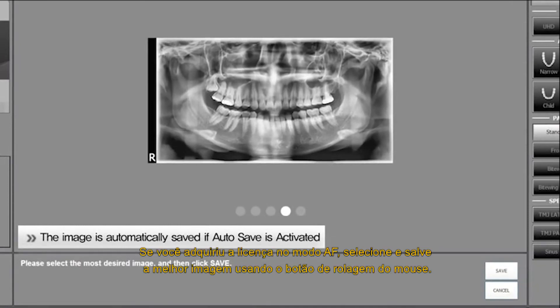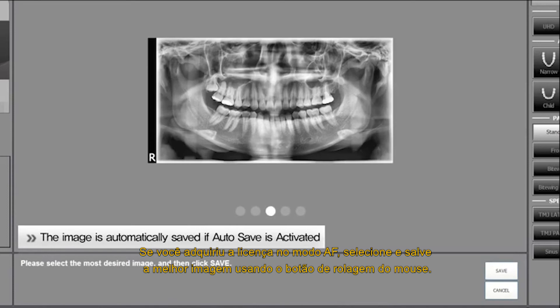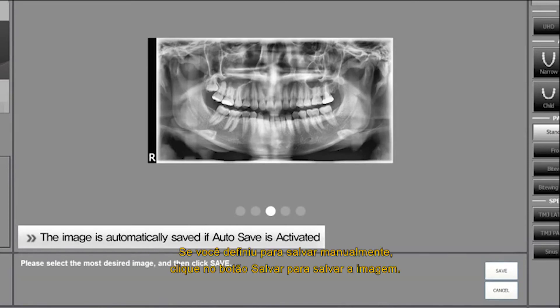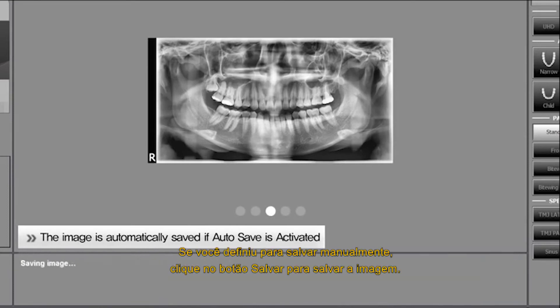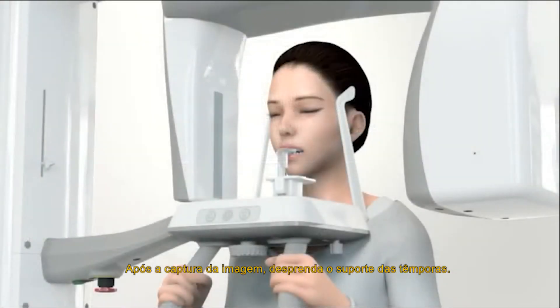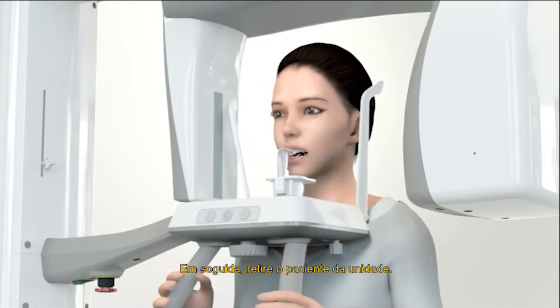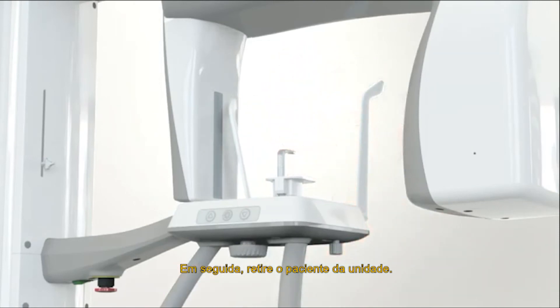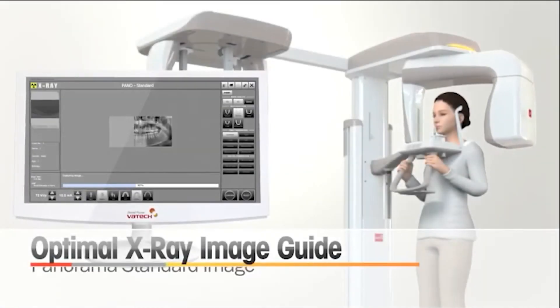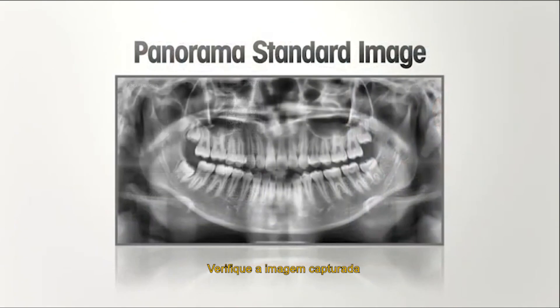If you purchased a license for AF mode, select and save the optimal image using the mouse wheel. If manual save is set, click the save button to save the image. After image capturing, unfasten the temple support, then guide the patient out of the unit. Check the captured image.